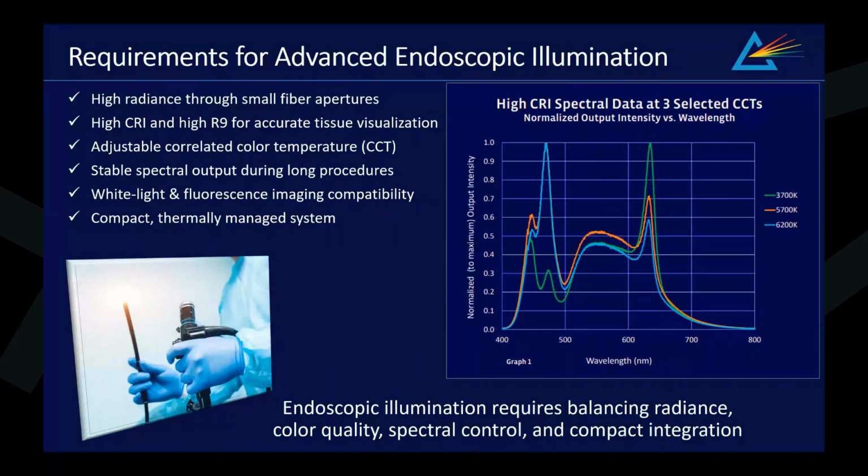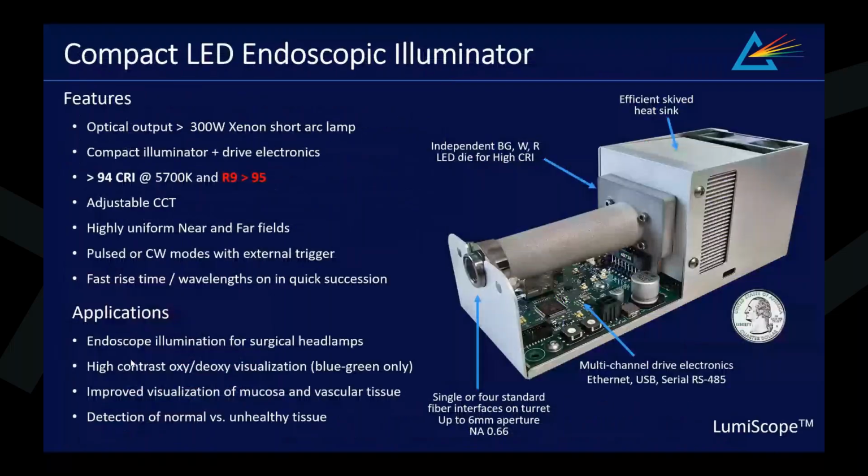However, the limitations of xenon arc lamps have become more significant as imaging systems evolved and LEDs improved. Arc lamp systems are mechanically complex, generate heat, have a limited lifetime, bulky architecture, and limited electronic modulation capability and spectral control. Integrating these performance requirements into a compact surgical illumination system requires close coordination between optical, thermal, electrical, mechanical, and systems engineering and design for manufacturing and cost.